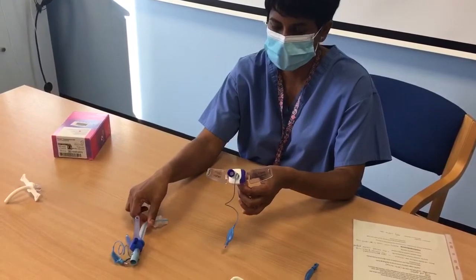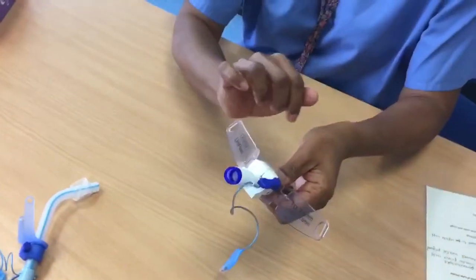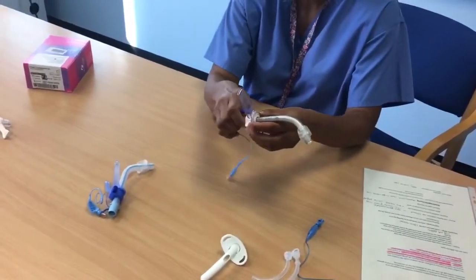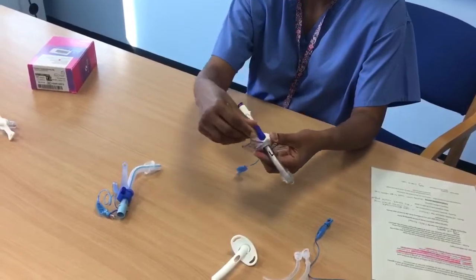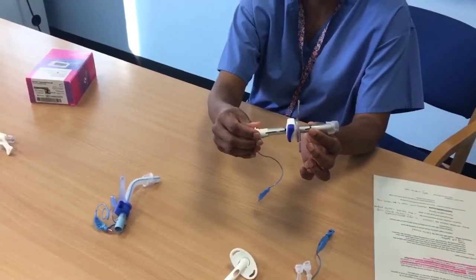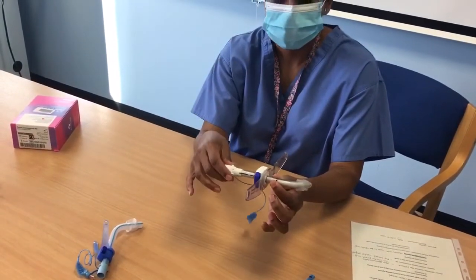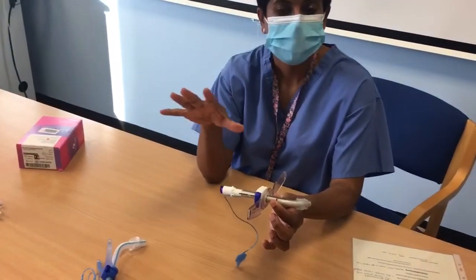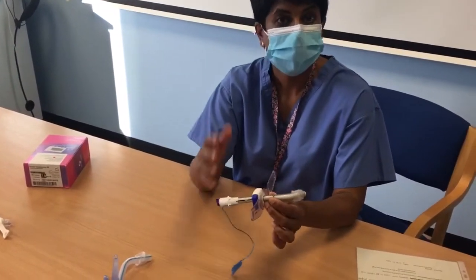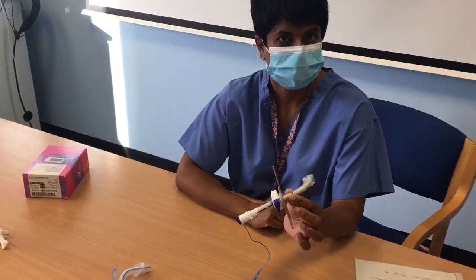Okay, so there are two types of adjustable flange, and you'll notice this particular one I'm showing you has a latch. So we would have the size measured out for our patient, and then we secure it by using our latch there and keeping the tracheostomy tube length secure. It's part of our safety checks. It would be a very good idea to have that written on the signage for our tracheostomy patient, or if you work in critical care, that will be part of your safety checks, the length of the tracheostomy tube.